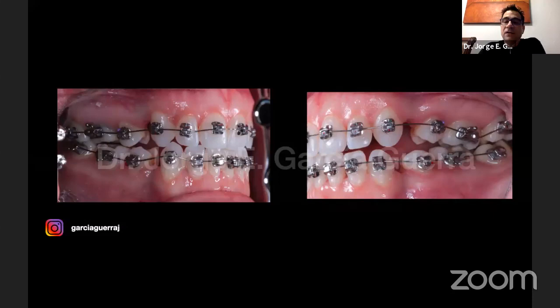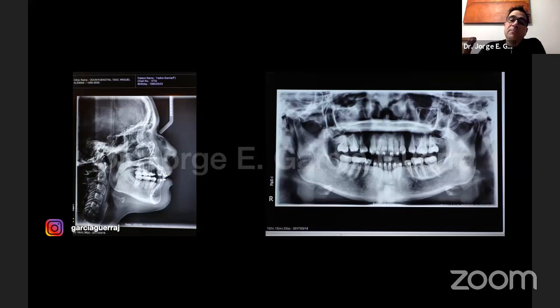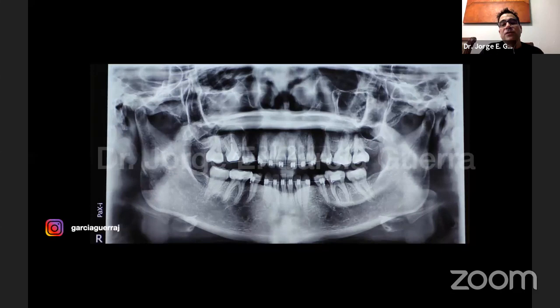Sometimes I don't do a lot of extractions. I do them when we need them, like in the case of the girl. But I also have a lot of patients that had already some previous treatment with the four bicuspid extractions, like these two cases that I'm showing you. So in this case is where we use mini implants.